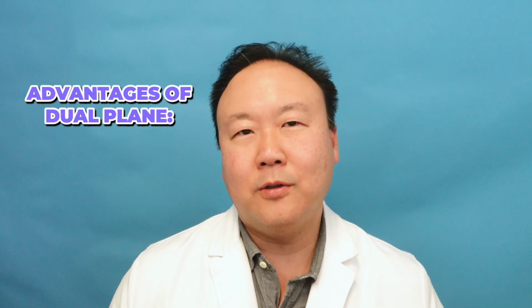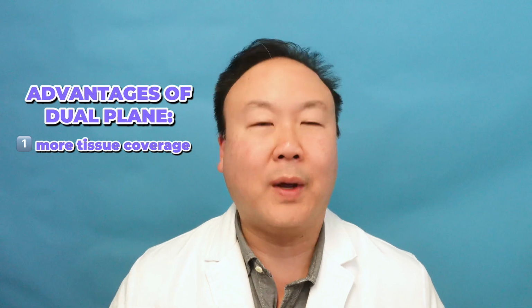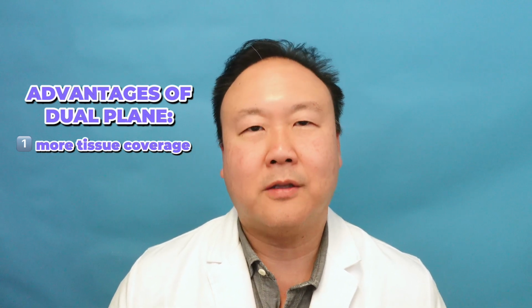This is why we as plastic surgeons call it dual plane, and this is why you as a consumer have no concept as to what we're talking about. But essentially, that's what we're talking about. The dual plane has a bunch of advantages, including a little more tissue coverage, because relying on the skin, breast tissue, and muscle to cover your implant, there's a little more padding there.